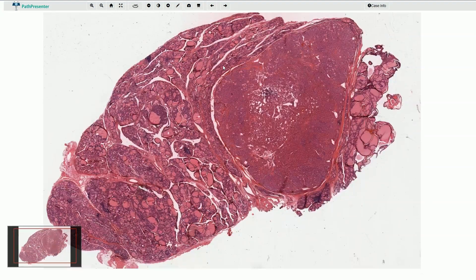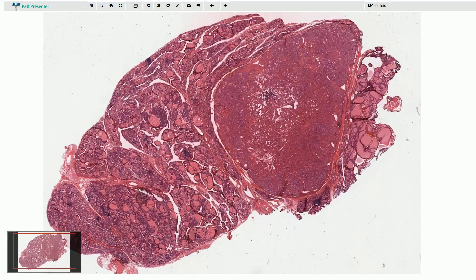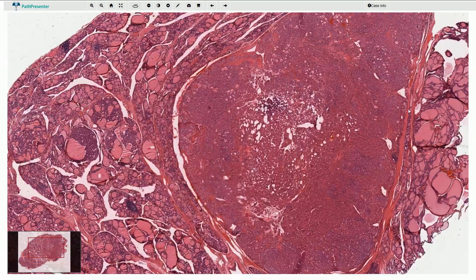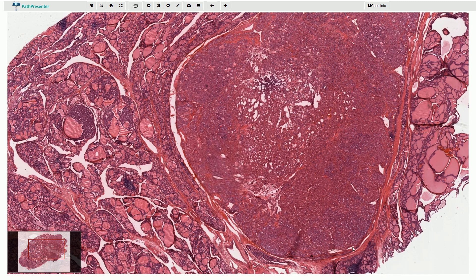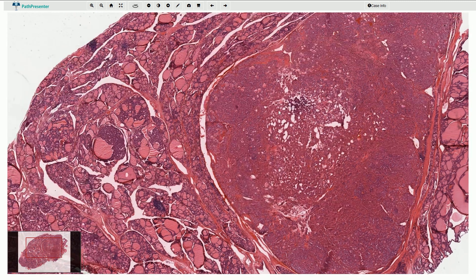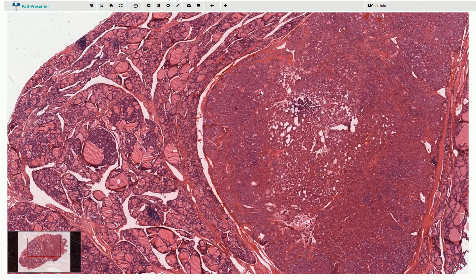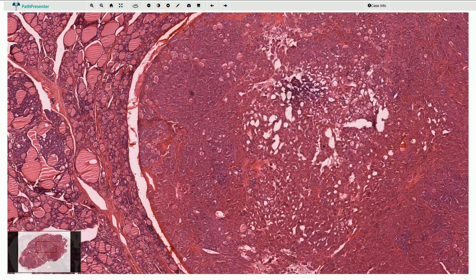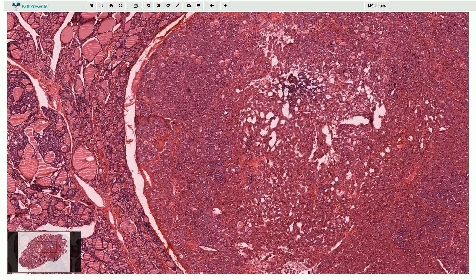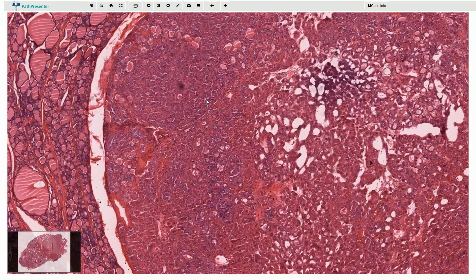Here we can see the thyroid gland with one well-circumscribed single nodule. The nodule is sharply outlined; somewhere we can recognize a thin fibrous capsule. Although we can see some follicles associated with colloid content, most of the nodule looks like solid tissue.